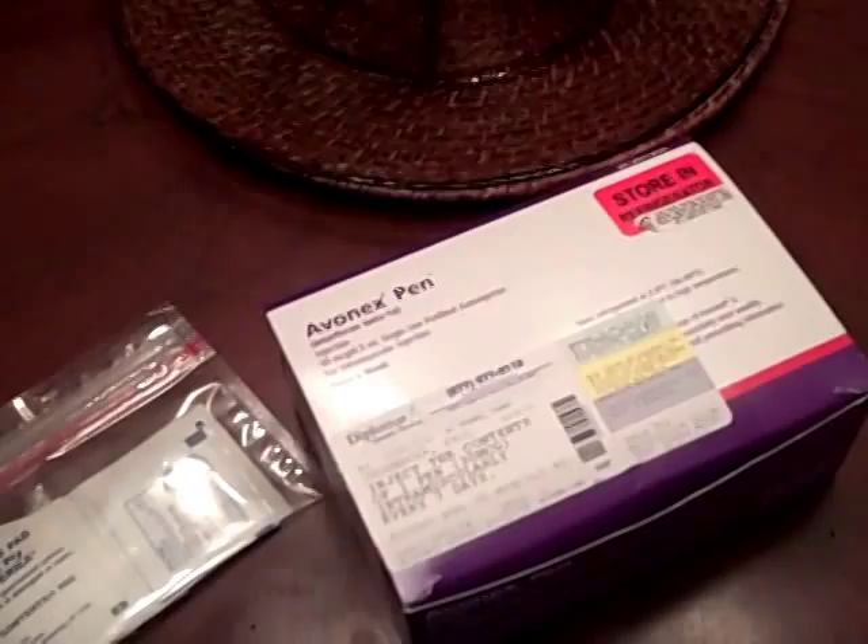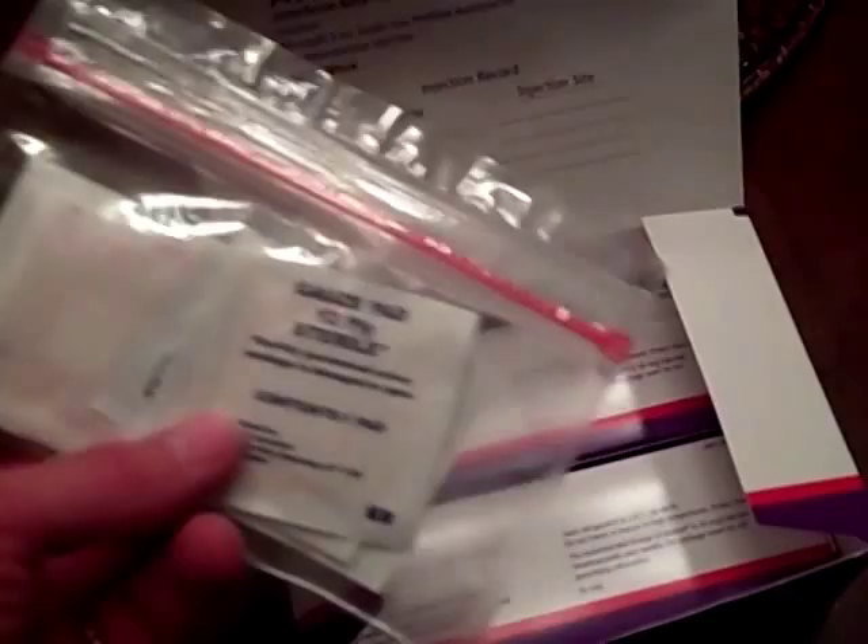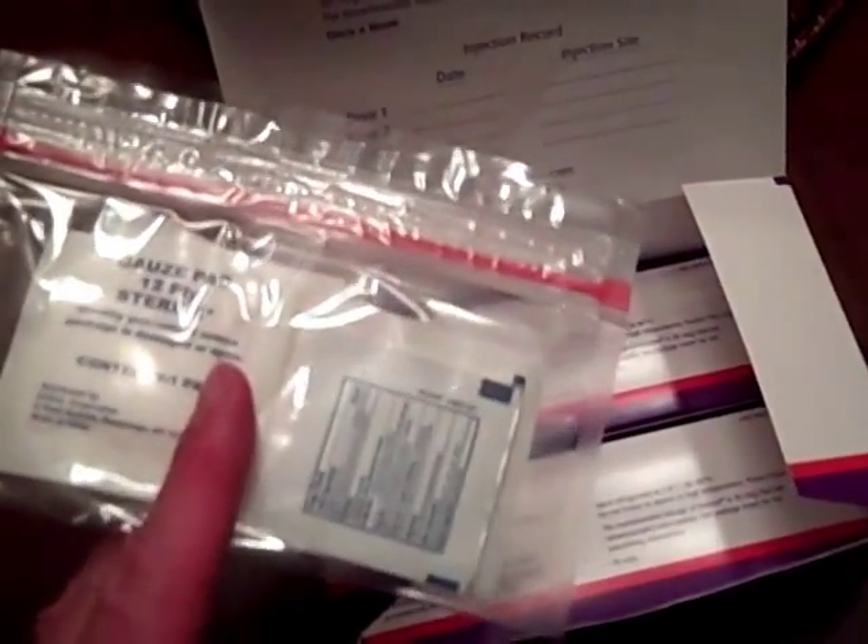Okay, next we'll get our package opened up. This is the four pack that comes in from the pharmacy. I've got two left in this box. It also comes with this package that has gauze, bandages, and alcohol wipes inside. So I'll take one of these out — number three of four.